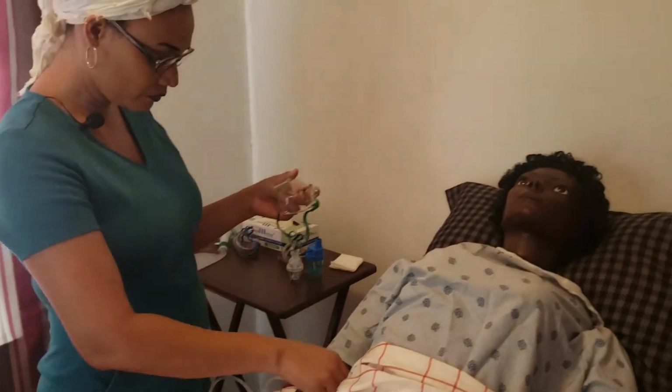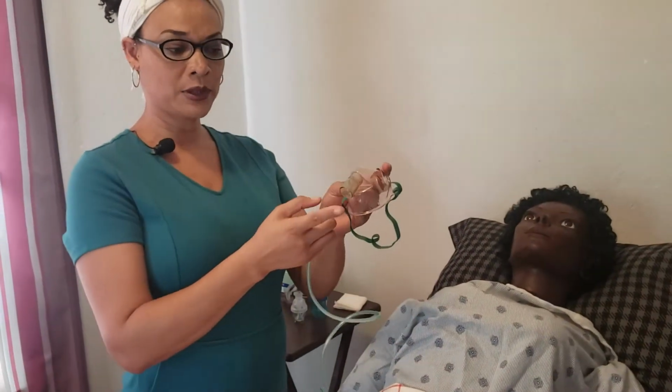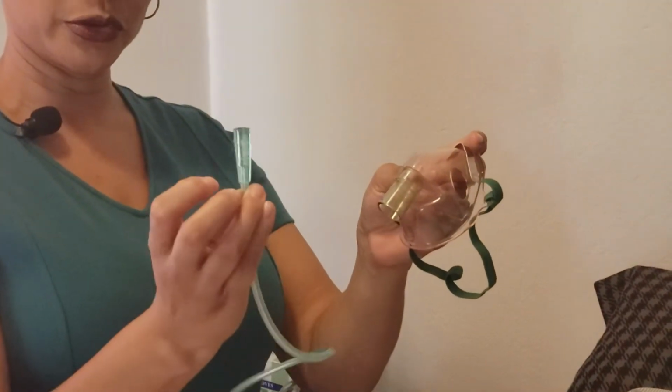So to set this up, there's a nipple that goes to the end here that has a point, and then you're going to connect that point onto your tubing. Then connect your tubing to the source. That source would have your humidified bottle. So in order to get this on right, make sure that you have the correct size for your patient.